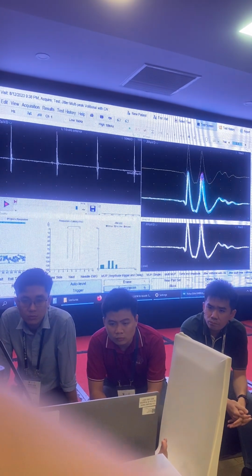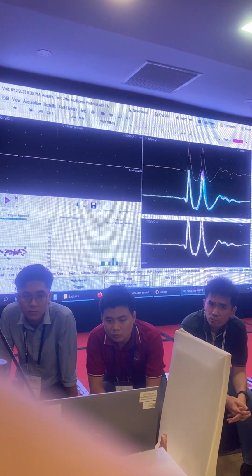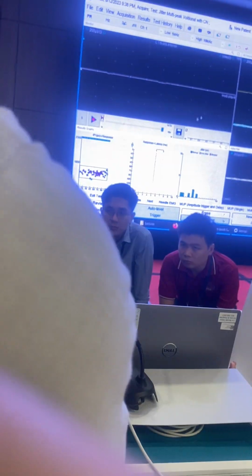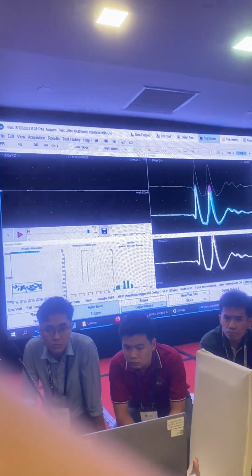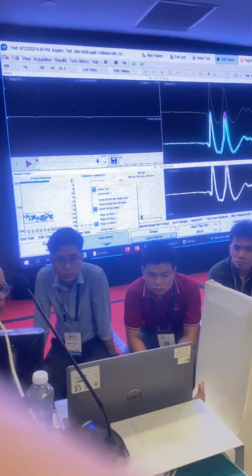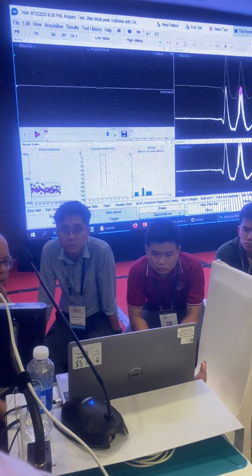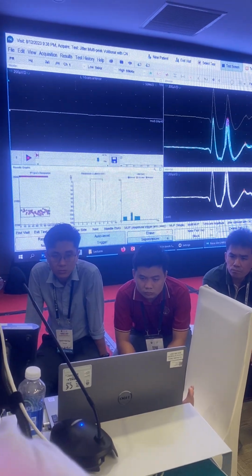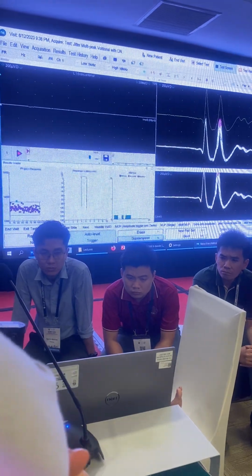So this is the one I get rid of. Anyway, so you get the idea of how to do the jitter analysis. And again, I can say this is going to be my trigger. This is the one that I want to get rid of. So I choose this. And that's the only one that I keep over here.